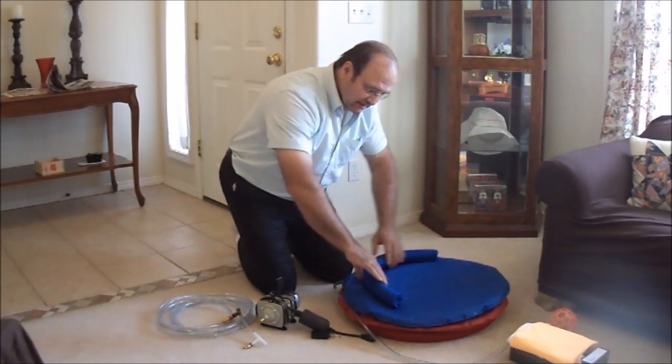Thank you so much for your time. Good luck with your use of the Personal Cushion Lift in your life to make it easier.